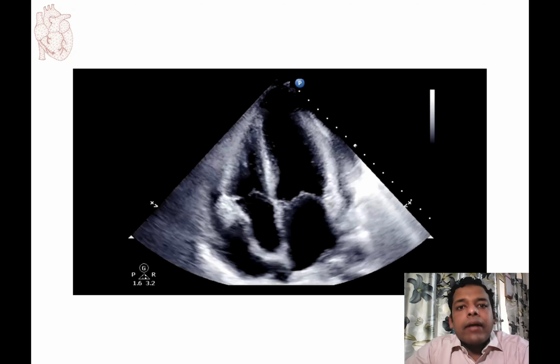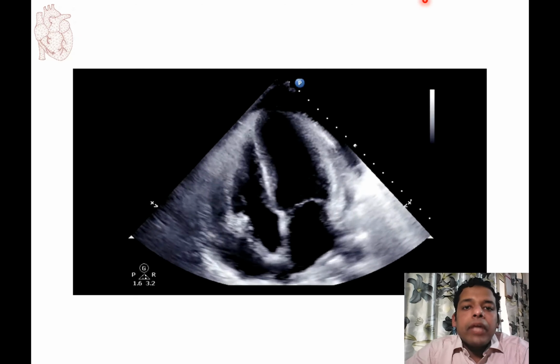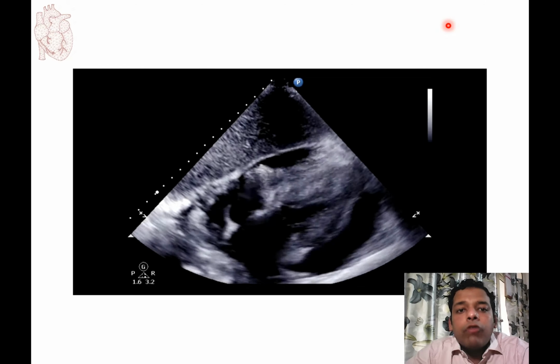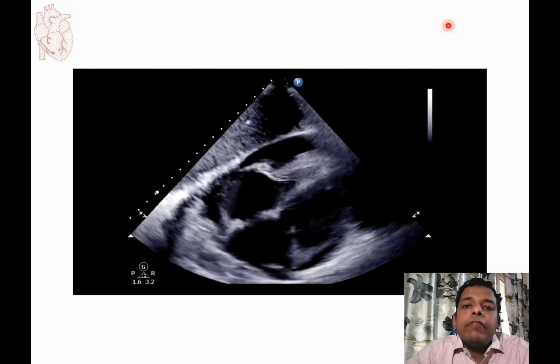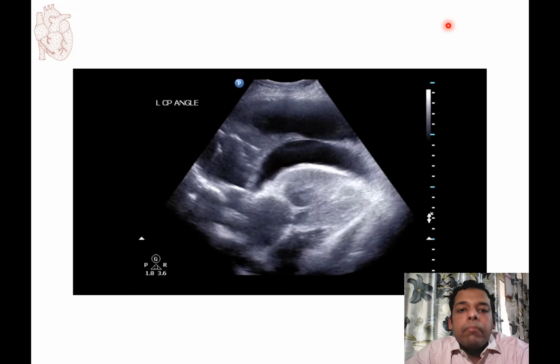Minimal pericardial effusion represents the normal amount of pericardial fluid in a disease-free state. It is visualized as a small echo-free space in the posterior AV groove only in systole when the heart is pulled away from the pericardium.